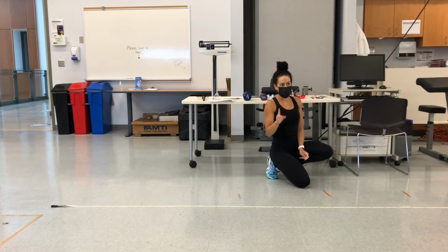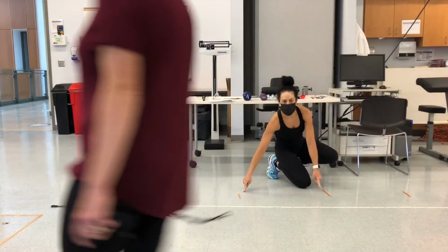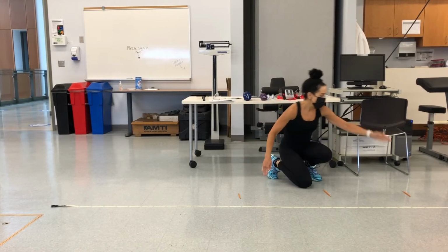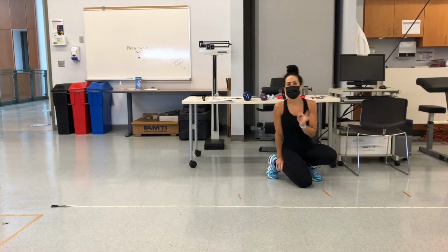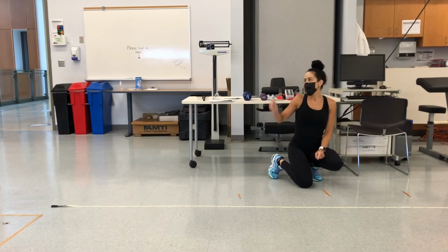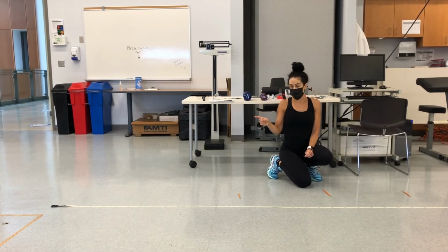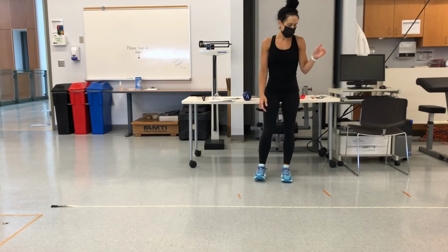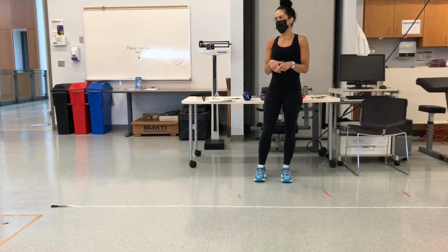Okay, so that was a little bit better. So in between these 2 pencil marks would have been 1 step, and in between here and the next subsequent footfall on the same foot would have been a stride. And then Christy would look at her stopwatches and she would tell me what the time was when she hit here and then when she hit here, and we would be able to record that.